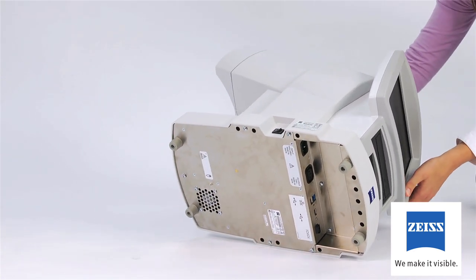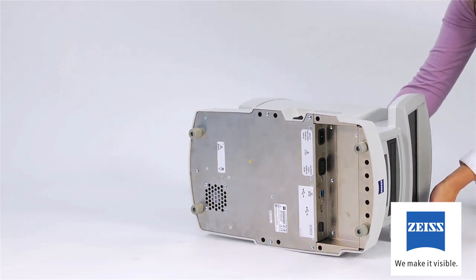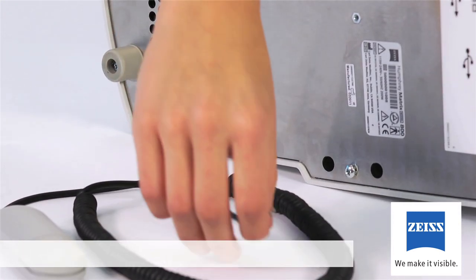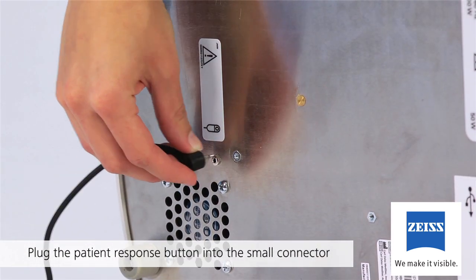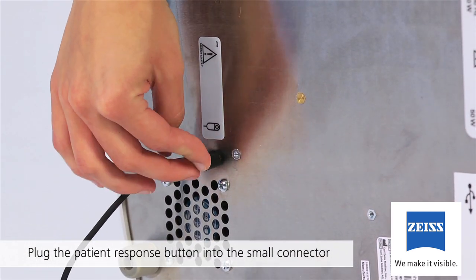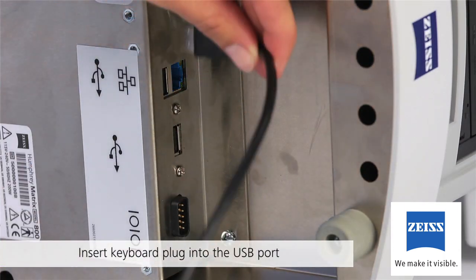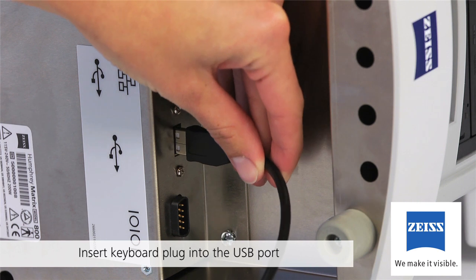Lay the instrument on its side, being careful that the patient visor isn't in a position that will cause it to support the weight of the machine. Plug the patient response button into the small round connector jack next to the patient response button symbol underneath the center of the instrument. Now insert the keyboard plug into the USB port as shown.